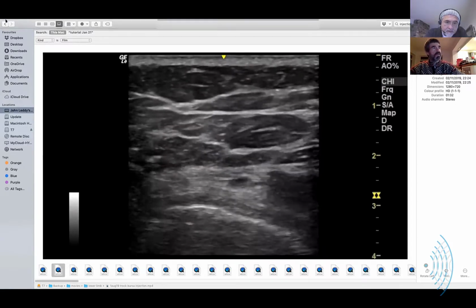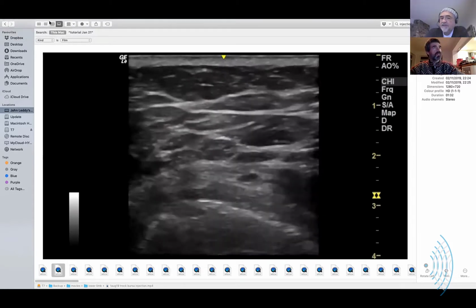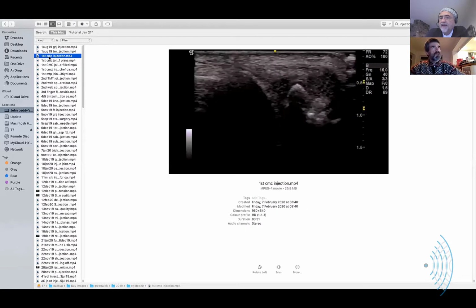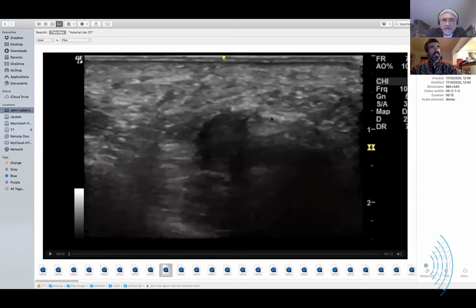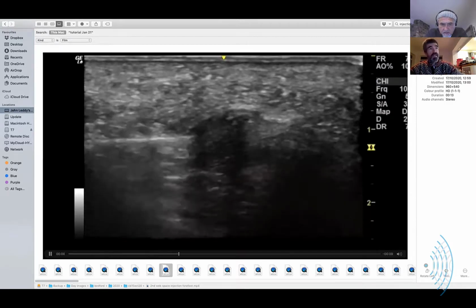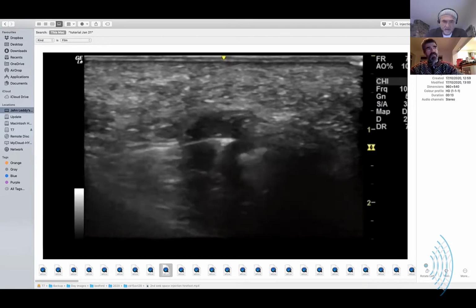I'm not seeing the tip perfectly in that one. But one does not have to see the tip if we start to see a distance developing under the fascial layer that we're looking to apply the injectate, right? Yeah, I think you'd have to be very careful to take that view. I should see the needle in almost every case. In the real world, if I'm absolutely sure that I'm in where it is, then I might. But I would certainly not be letting my students.